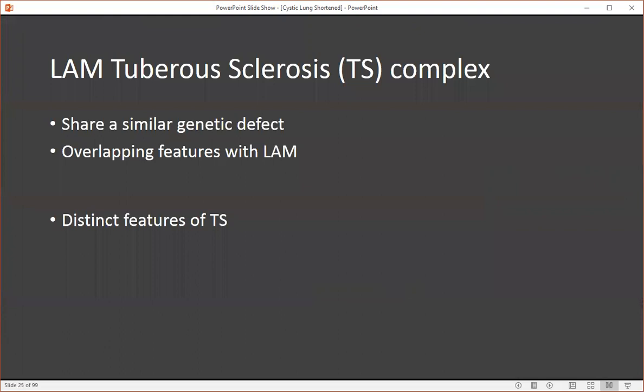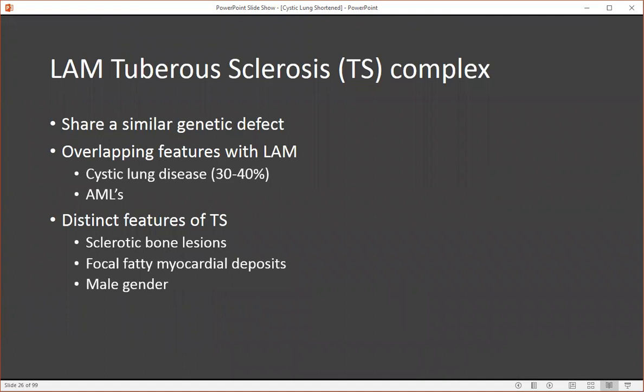The tuberous sclerosis LAM complex shares a similar genetic defect, resulting in overlapping features with LAM. You can see cystic lung disease in tuberous sclerosis, though only seen in 30% to 40% of cases, as opposed to LAM where you see cystic lung disease in virtually all cases. These are also associated with angiomyolipomas, similar to lymphangiomyomatosis. Distinct features of TS LAM complex include male gender, widespread sclerotic lesions, and focal fatty myocardial deposits. These can be confusing when first seen, as they can resemble osteoblastic metastasis and subendocardial remote infarcts.